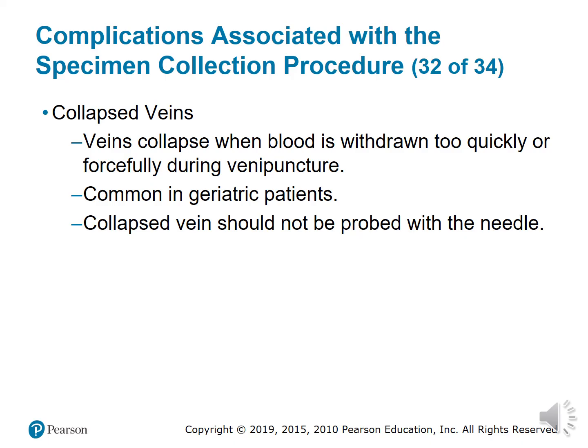Collapsed veins. Sometimes when a phlebotomist goes to collect blood from a patient, their veins may collapse in the middle of a draw. This is caused by either the forceful or quick withdrawal of blood during a venipuncture, especially if the patient has small veins.